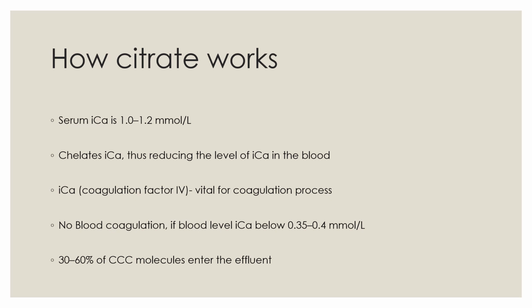RCA anticoagulation is thus achieved only in the CRRT circuit. This is the reason it is called regional anticoagulation, with little interference with the in vivo coagulation process.